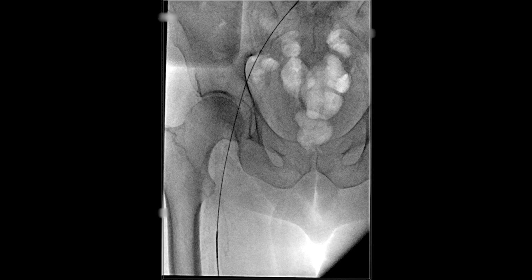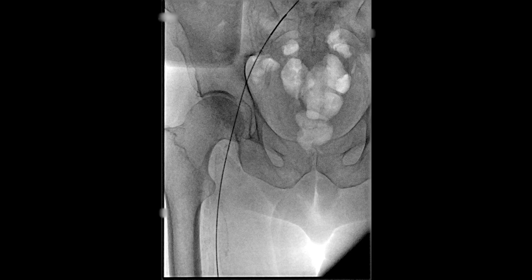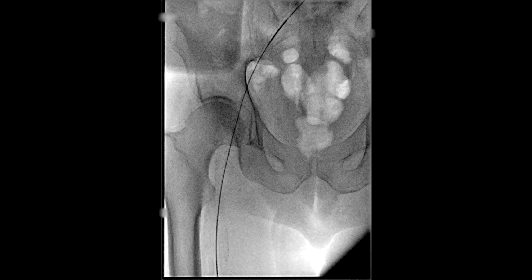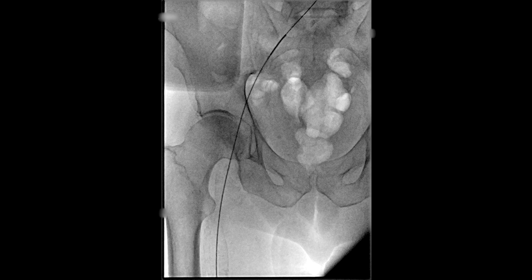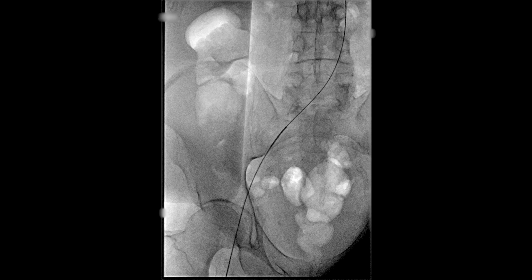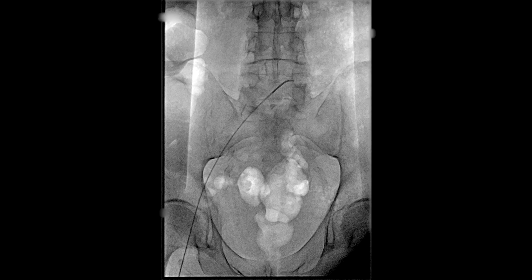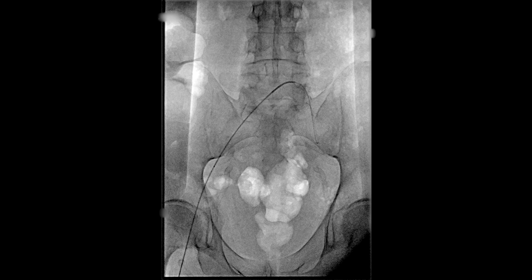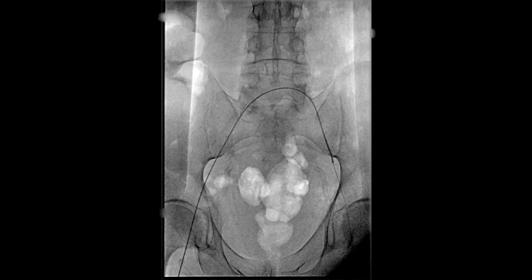We hope to be able to clear the remainder of the thrombus using a clot retriever, as it is significantly more efficient at removing chronic thrombus. We therefore pass a Berenstein catheter over our wire and then retract our wire once the catheter is in the inferior vena cava. The patient's right common iliac vein is then cannulated using our catheter and our Advantage wire.